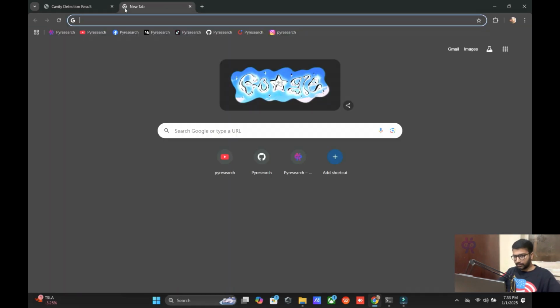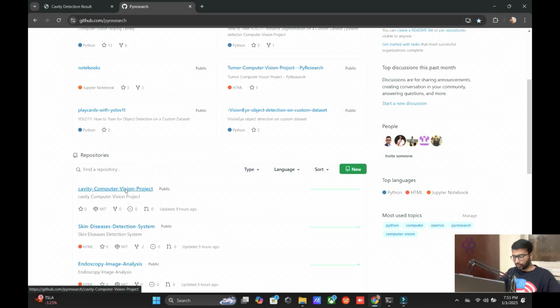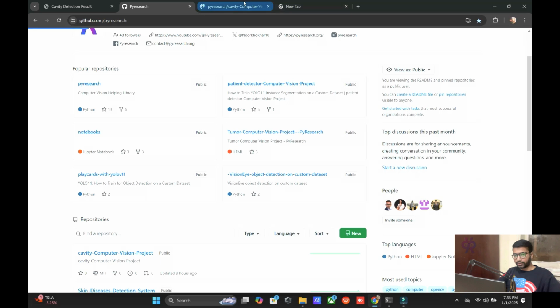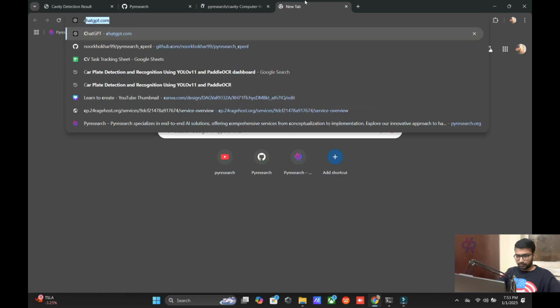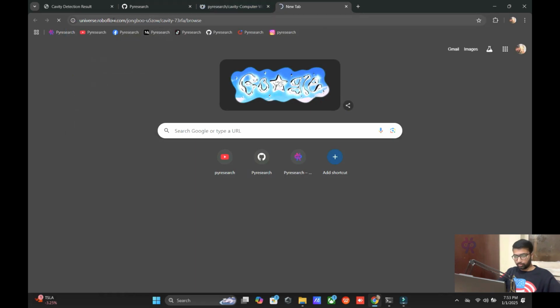Go to the Pyresearch GitHub account. You can see it here, and here you go, download the code from here. Okay, and let me explain how to train the data. I have a model, but we are going to go step by step. Here, click the notebooks and download the code from here. And the cavity dataset. So we get the dataset from RoboFlow, and it's very simple for you guys.